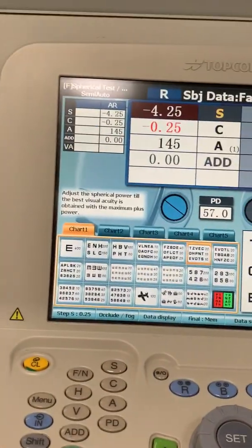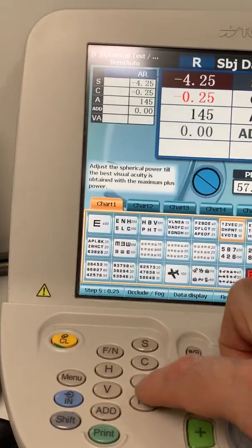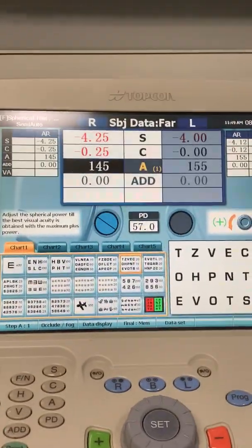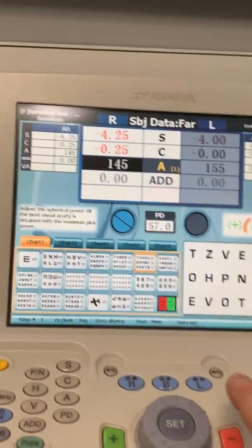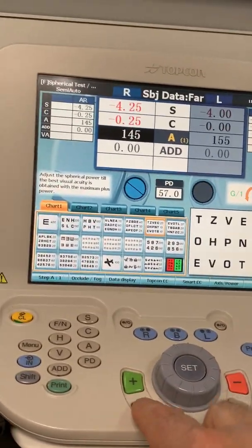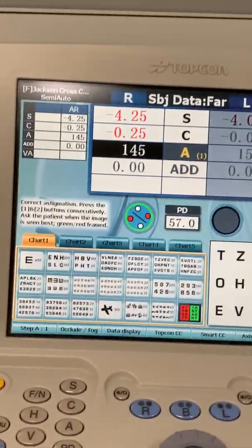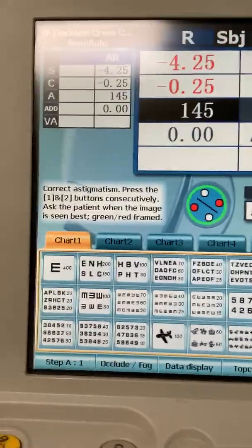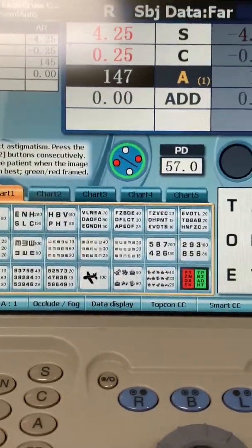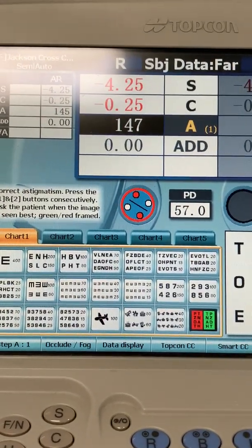When we're fine-tuning the cylinder power or the axis, we can hit the A for axis. Then it's going to be 1 and 2 — which is better, 1 or 2? And we just follow the little red dot. It's just like the Jackson Cross cylinder: which is better, 1 or 2? We just chase the red.